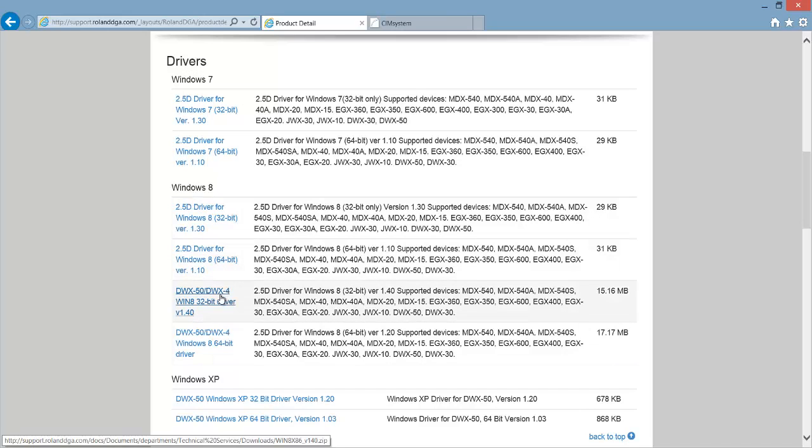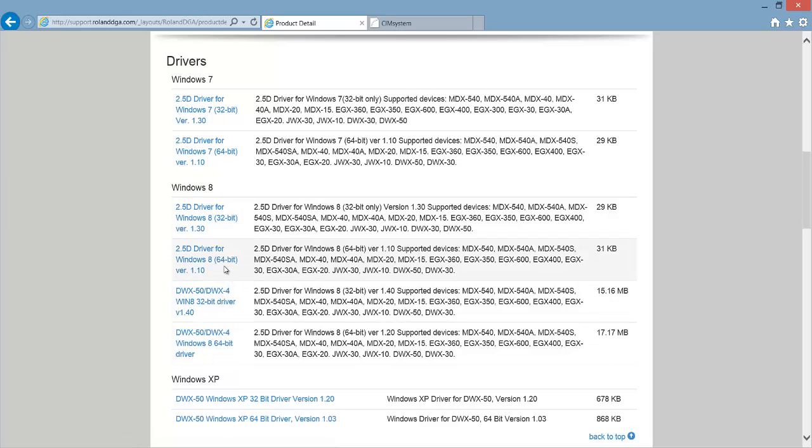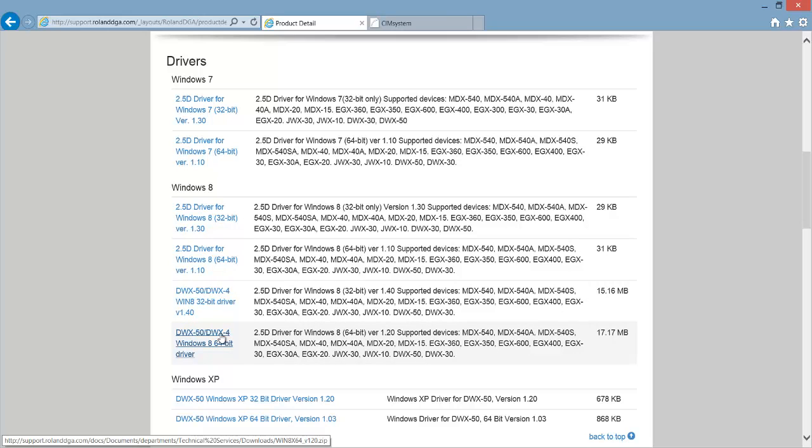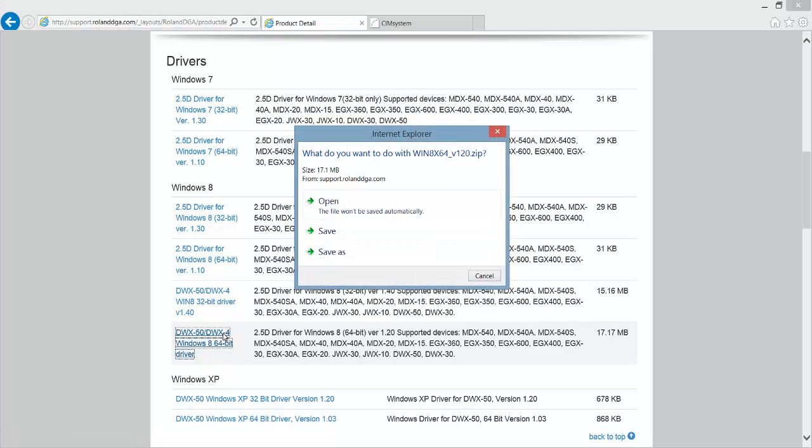Once you've found the right operating system for what you have installed, look for either the 32-bit or 64-bit version of the driver, and then download that based on what your operating system is. Then click save.